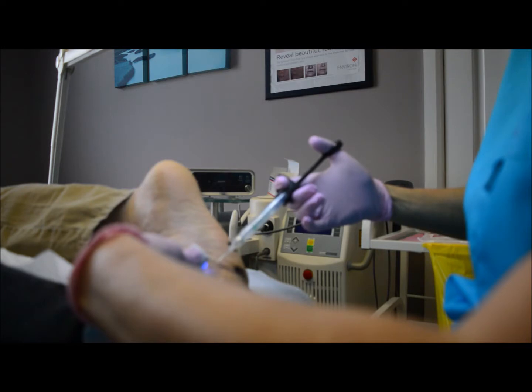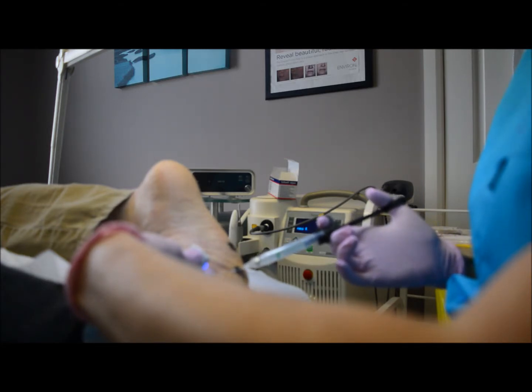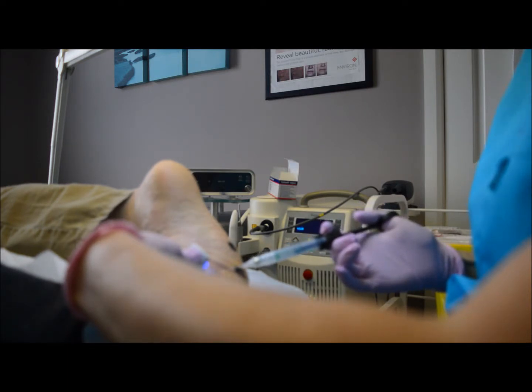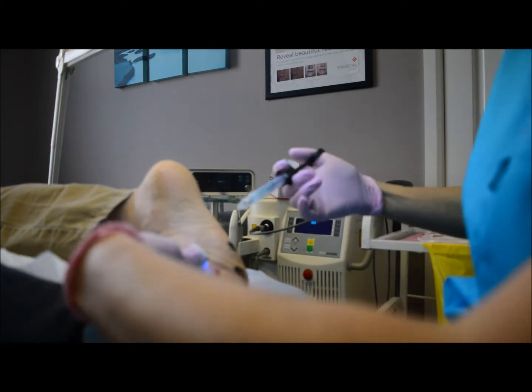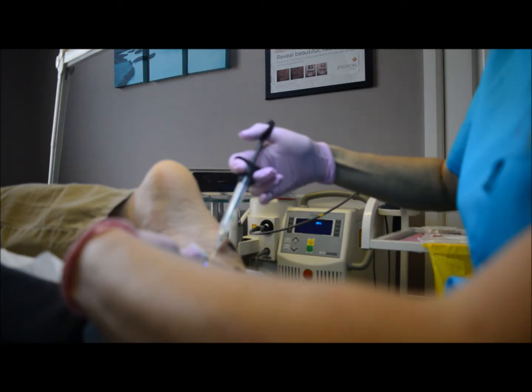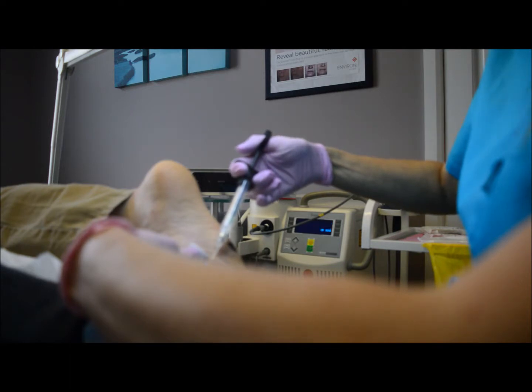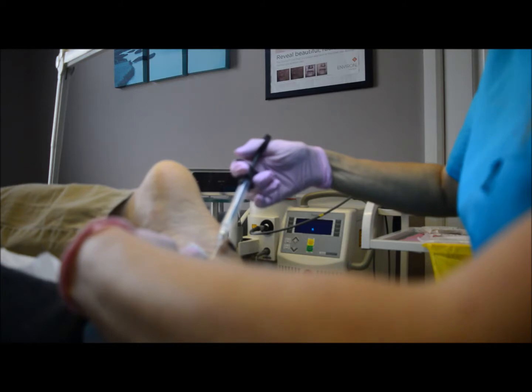The bit that always hurts is when you're actually putting the analgesia in, more than the actual needle — that's what's actually uncomfortable. I'm putting quite a bit in there and also coming down to put a little bit more in. You can see it's beginning to whiten up underneath. Without using this device it's nigh on impossible to actually inject anything into the sole of the foot. Normally for laser procedures I would do a tibial block, but the disadvantage is it's a longer procedure and the patient can have a numb foot for up to three hours, whereas with this procedure it's wearing off within an hour or so, although you can get some numbness and tingling into the toes. You can see it's nicely spread in there.